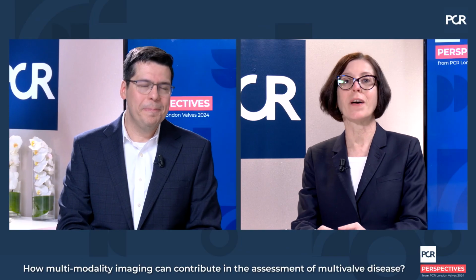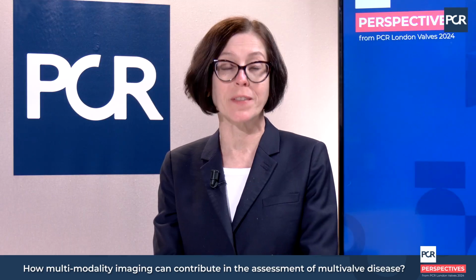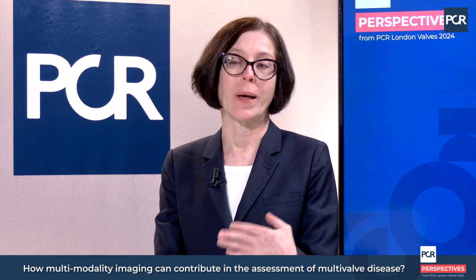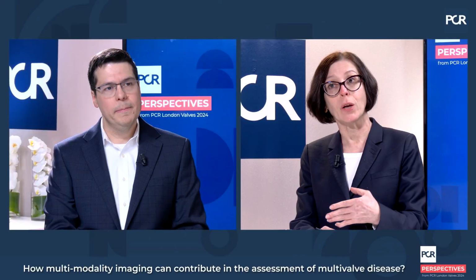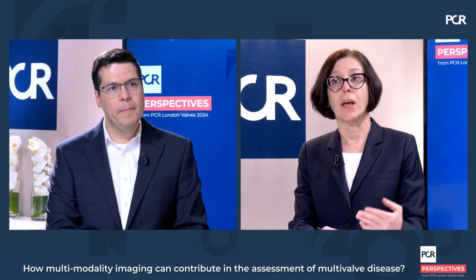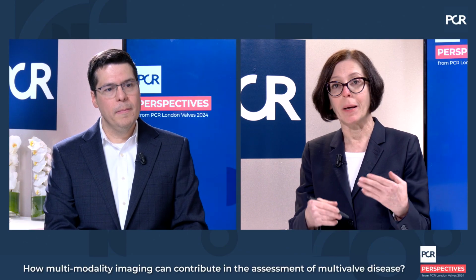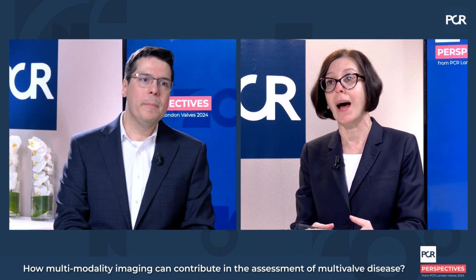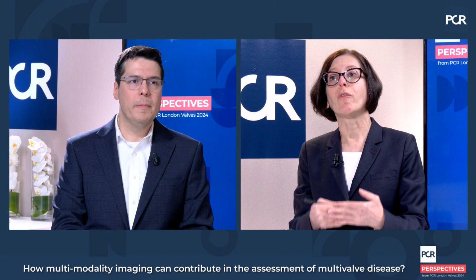Thank you, Joao. That's very helpful. So when we see multi-valve disease for assessment of severity, we use multimodality imaging to enhance our ability to have an accurate assessment. Particularly, you gave the example of CT in aortic stenosis with low flow. And when we have multi-valve disease, again, we can use multimodality imaging in the form of MRI for a reliable, reproducible method of follow-up of patients with multi-valve disease.